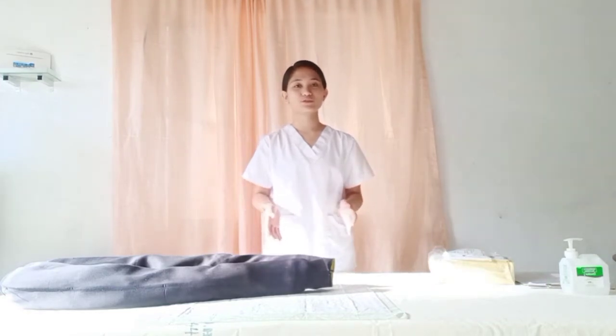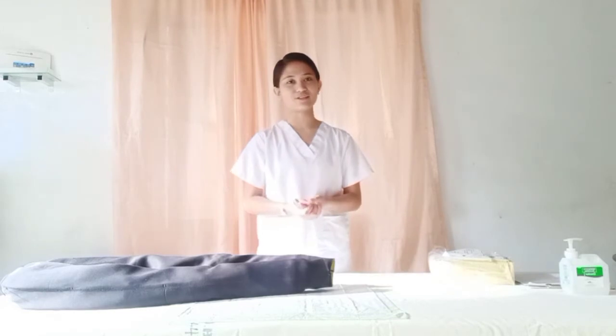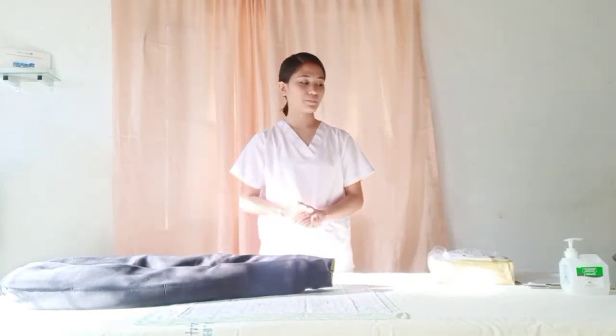I'm Catherine, a student nurse of Adventist University of the Philippines, and today I'm going to show you a return demonstration of performing a urinary catheterization on a patient. So the first thing that we will do is, of course, check the chart of our patient.